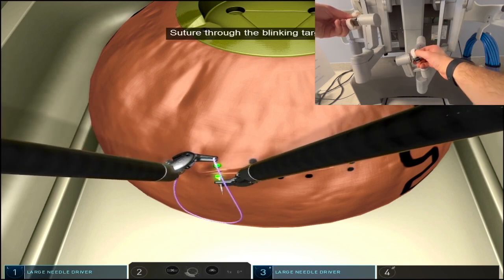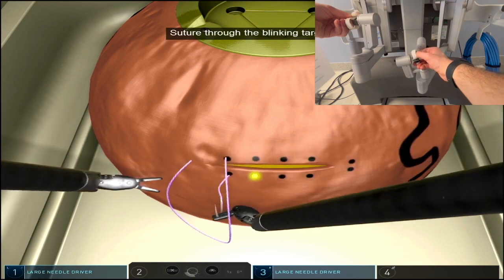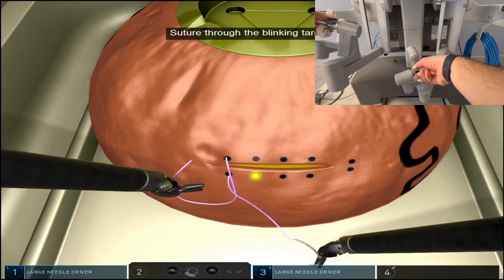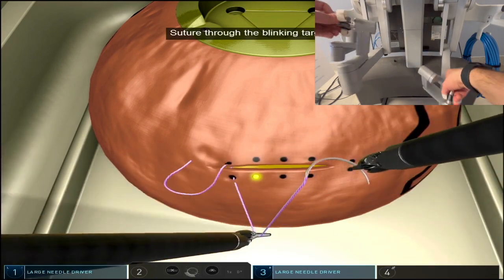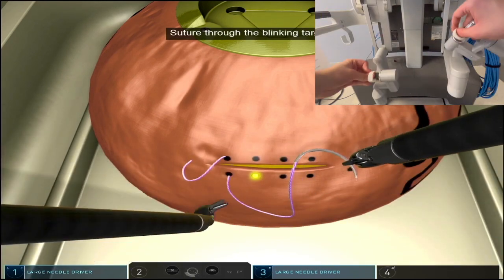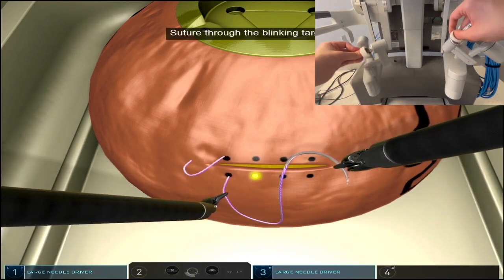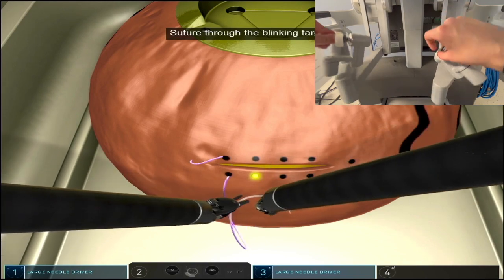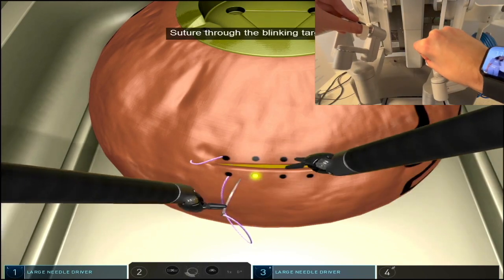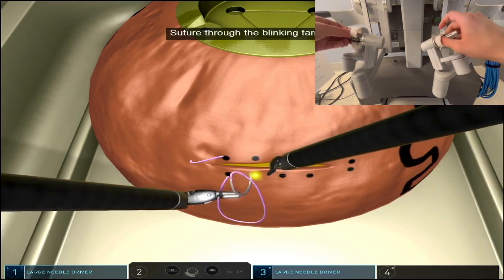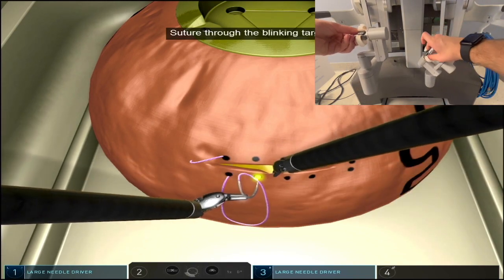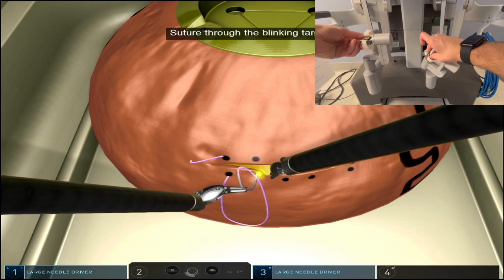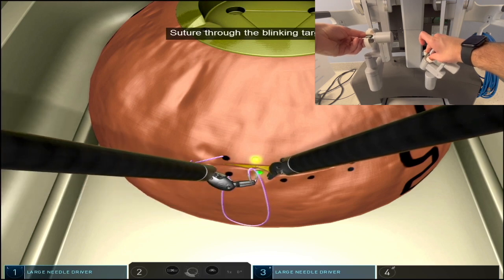When you're pulling your needle out, you can do this little trick to pull out the rest of the suture. For the bites that are from towards you to away from you, that is from proximal to distal, you want to take those bites in backhand.